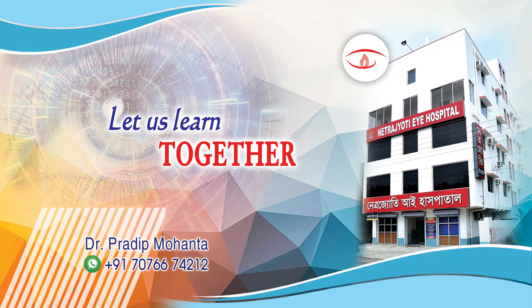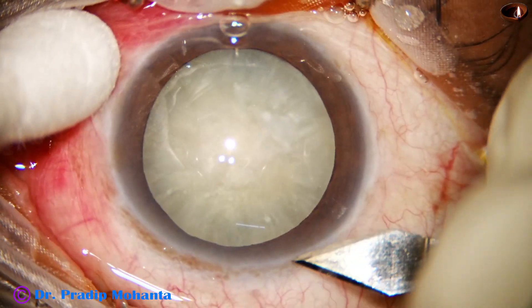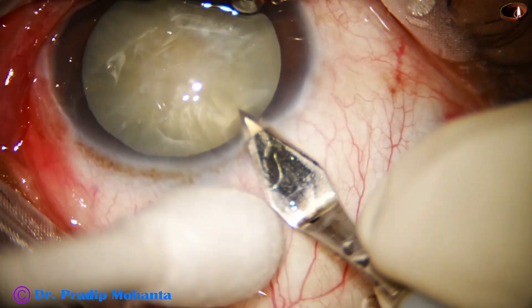Friends, welcome to my workplace at Ranaghat, West Bengal, India. This is a mature cataract with anterior capsular fibrosis. Let us observe this surgery.